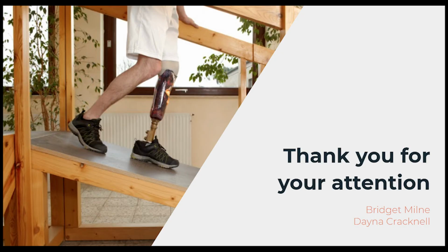To answer our research question, we now know that it is beneficial to tailor both the thickness and the stiffness of the prosthetic liner. We found that this reduces the compressive stresses experienced and therefore limits the chances of tissue irritation, breakdown, and blistering. We also recommend further investigation into hyperelastic materials to mimic the superior cushioning that adipose exhibits. Thank you all for your time and attention today.